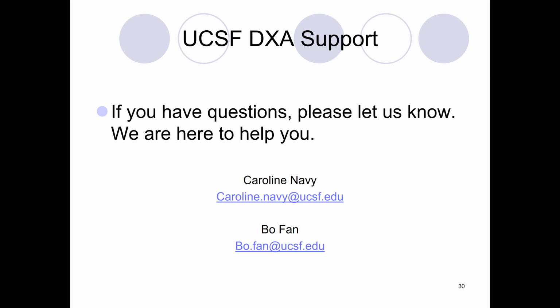Hi, yes, it's Anne. I have just two questions. Thanks for the presentation. For the dominant arm, we're going to be scanning the non-dominant arm. I just wondered if there was any particular standardization or standard method you'd like us to use to establish what the dominant arm is. For example, we usually go with the writing hand. Bo, do you have any preference? I know Bo mostly scans for studies. Yeah, that's right. Using the writing arm, that's fine. Or you can ask which arm you use when you hit the ball. Okay, great.